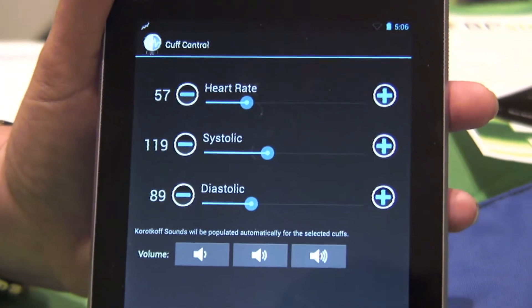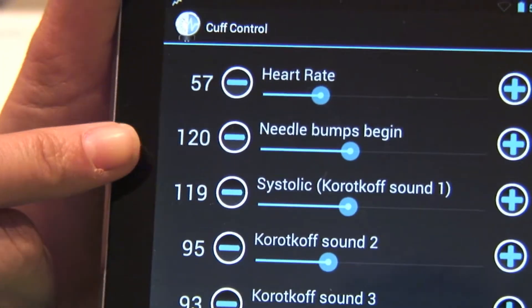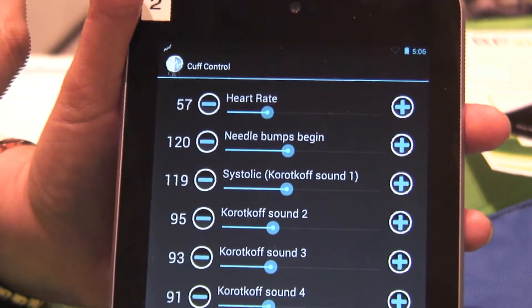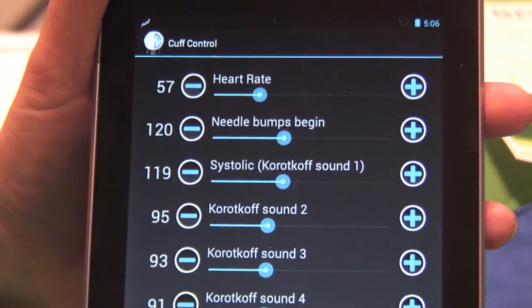If you're looking to do more advanced disease processes, you go into this mode, which allows you to set your heart rate, where your needle bump begins, and where the systolic is. In a normal patient, the variable is about three to eight — you actually see the needle bump about three to eight above where you actually hear your systolic pressure.